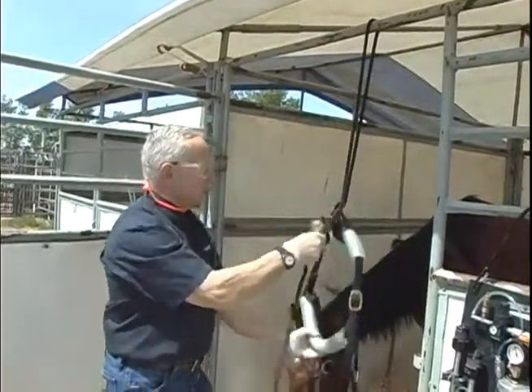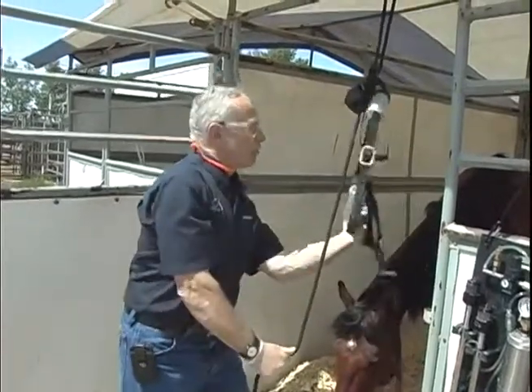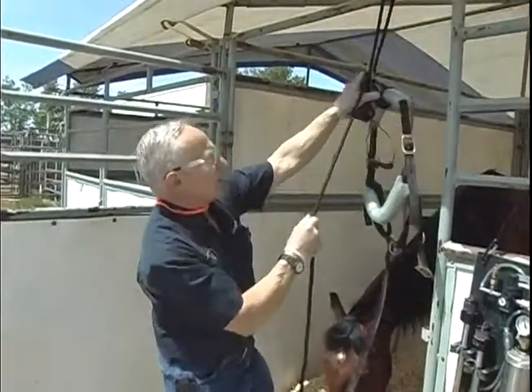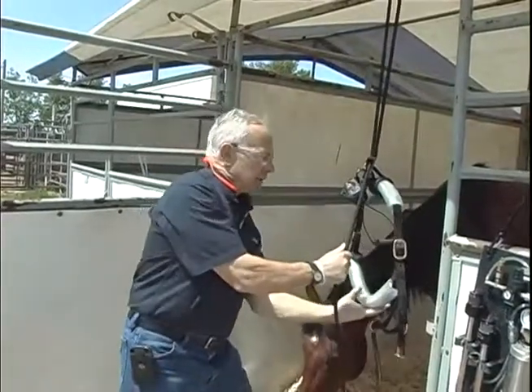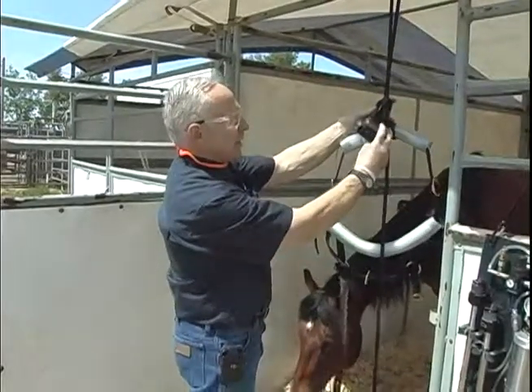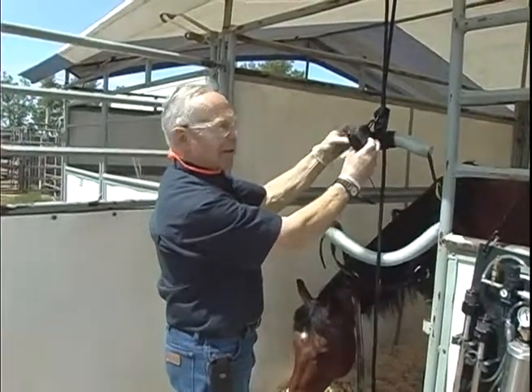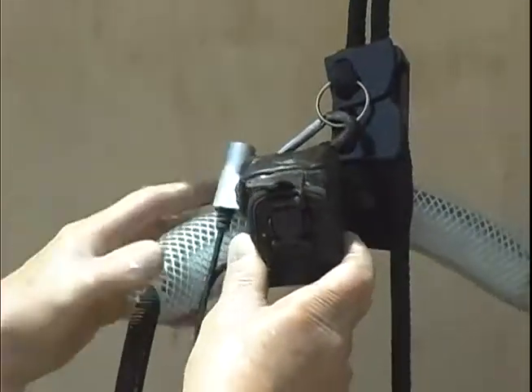It's much easier to lift the horse's head up by pulling up on the chin and pulling down on the rope than it is trying to push up like this. It's very difficult to get it up like that, but it's quite easy to lift up on the chin and pull down on the rope. I have the PowerLight attached to the top of the dental halter with some washers here just to hold it up there.